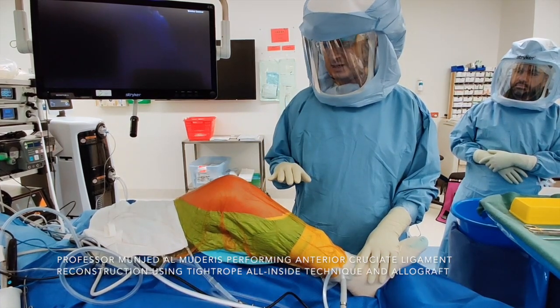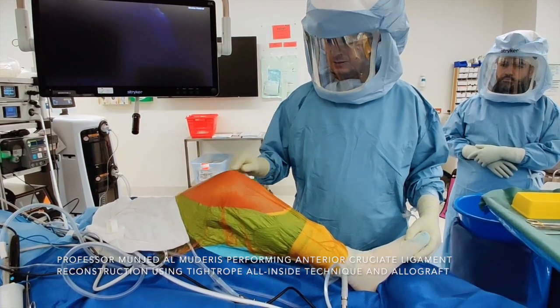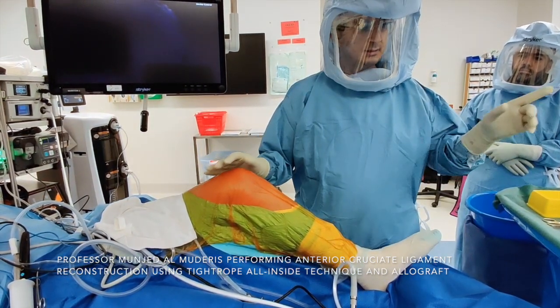The patient is positioned supine on the table, with back support and a bolster under the foot, and the knee is positioned at 60 to 80 degrees of flexion. I don't inflate the tourniquet until I prepare the graft.